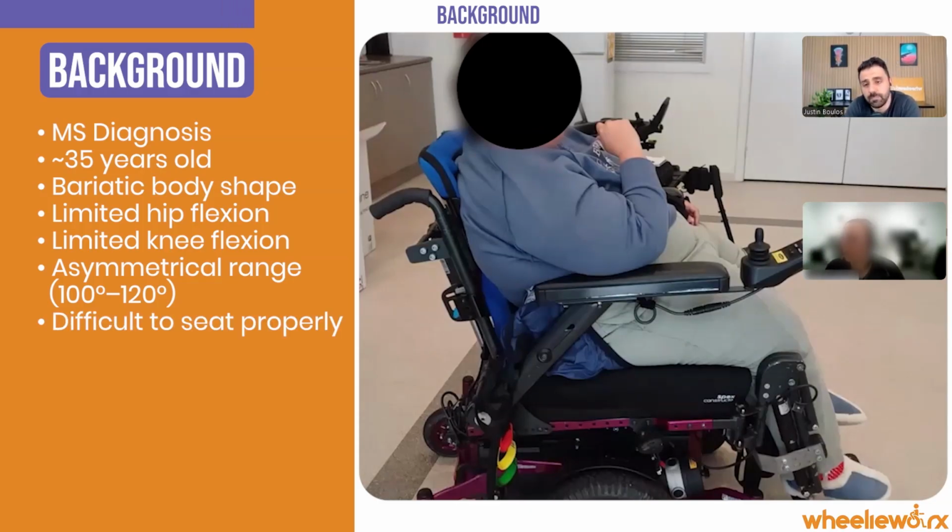Yeah. She's obviously quite large. So she's hard to see. And then very wide, we've got a lot of spread. So the cushions and stuff are hard because she almost just sits on top of them, rather than in them. It just means the cushion's not the right size. If you're sitting on top of them, we'll probably need to go a wider cushion.